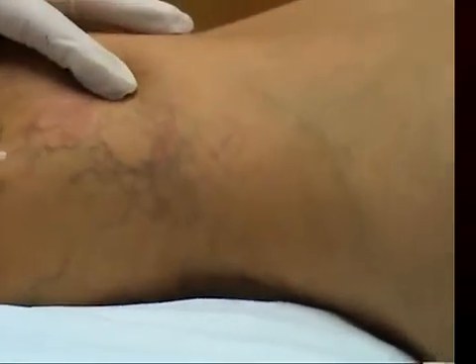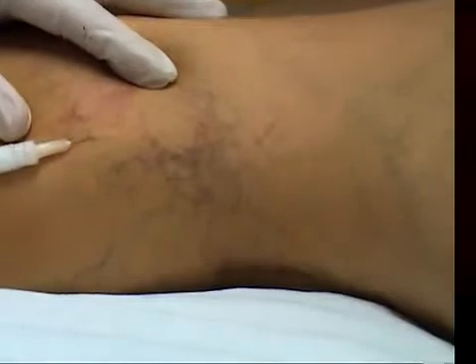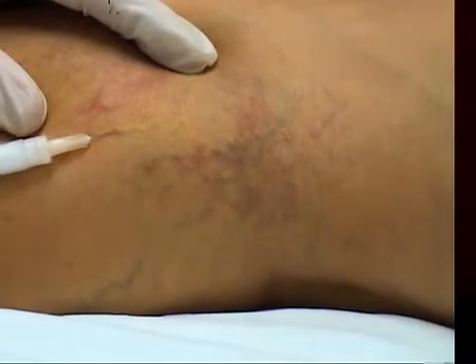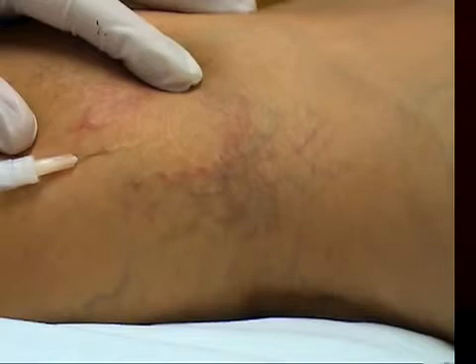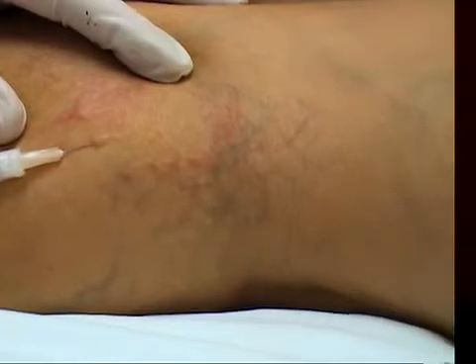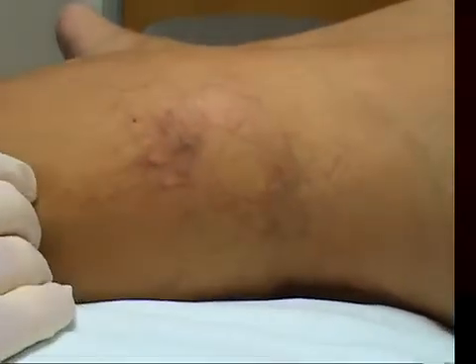I've got more foam I'm going to put in here — foam on foam. See that's going nice again. Don't inject too hard. We've got foam just north of the site that I'm injecting, so all these veins look nice and white now — they're all foamed. There's a bit of extravasation again. Obviously you don't want to extravasate, but just a little bit won't do any harm. Plus, don't forget that three quarters of this is air, so it's even better.